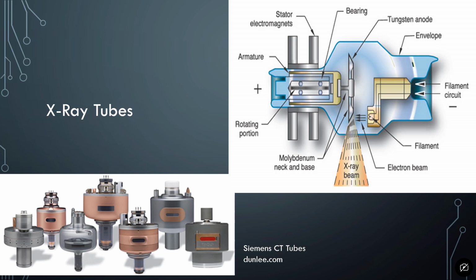So we actually want the characteristic X-rays, and the Bremsstrahlung just happens with it. But we don't want a lot of other things. We don't want scatter. We want those electrons to be directed straight at the anode. And so the best way to have that as a controlled environment is to have that in a vacuum.